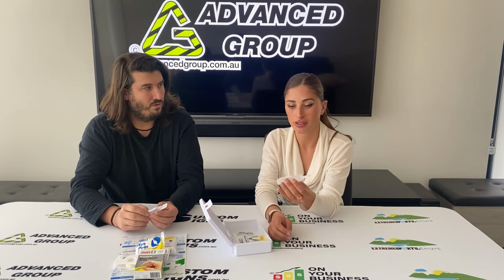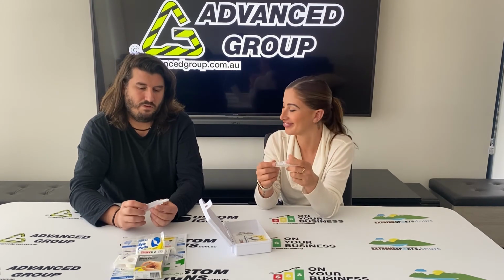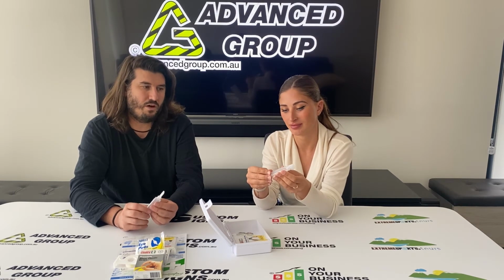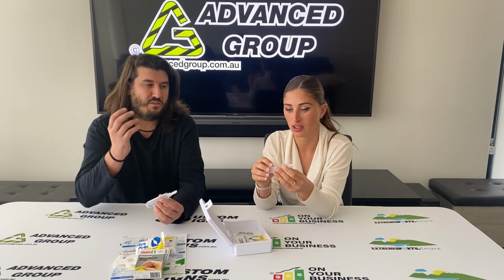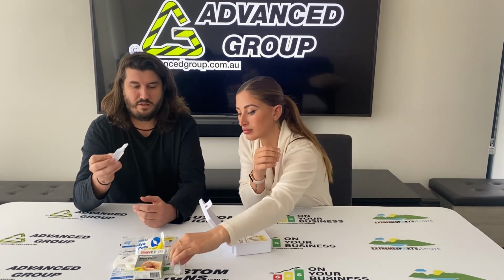It's quite generous. Would you use a lot of this? No. So it would be proportional to how much chemicals or whatever is in the eye. Some people might only use a half at a time or a quarter at a time, because if it's a little speck of dust, it might come out within the first quarter of this, and then you just throw the rest away. But you might have 4 goes at it to get that little bit of dust out of someone's eye.